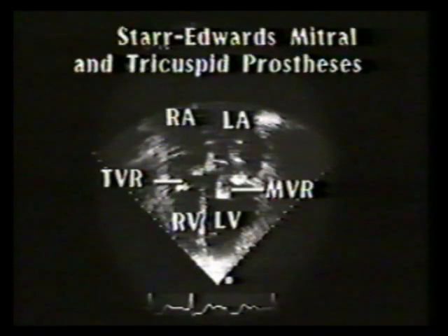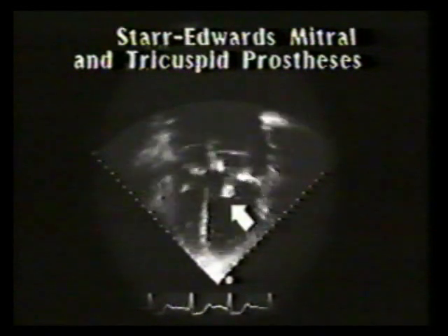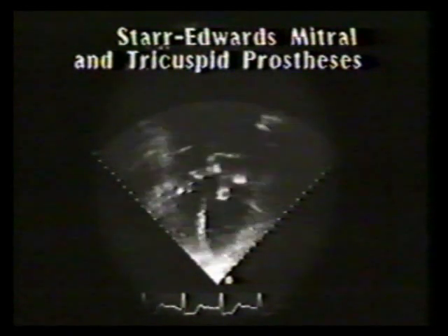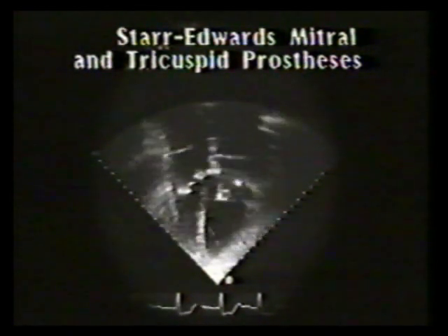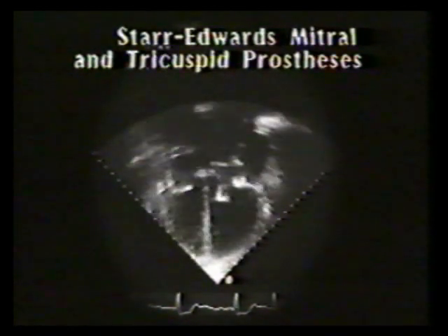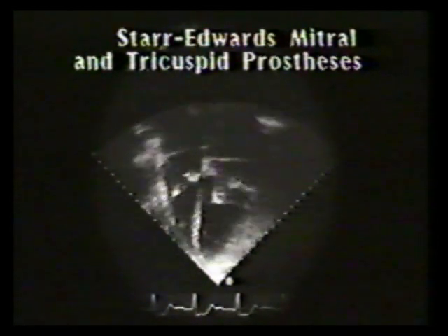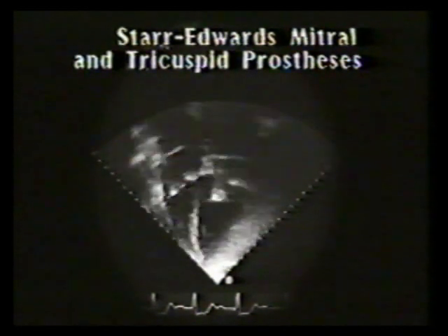This is an apex-down, 4-chamber view from a 62-year-old male with mitral and tricuspid Starr-Edwards prostheses. The mitral and tricuspid poppets are moving freely. The transducer has been tilted inferiorly to image the tricuspid sewing ring. There is no evidence of dehiscence.